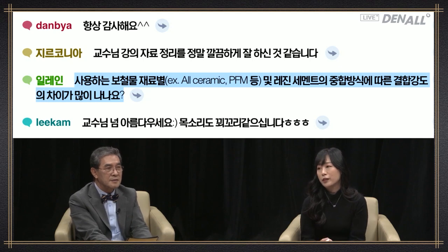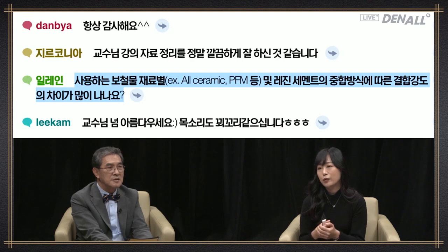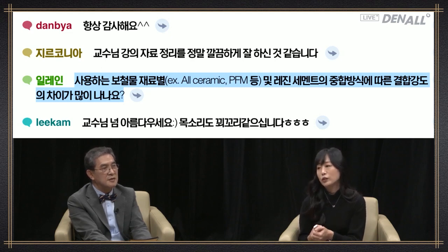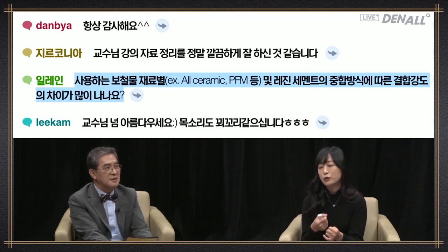as you have asked, in the case of non-precious metal alloy, it is very chemically unstable and it has metal ions, and therefore it has good chemical response with cement. The best is metal crown, metal or PFM crown, followed by gold alloy, and then ceramic. Zirconia is the worst, and glass ceramic is preferred after gold. So, metal, glass ceramic, and zirconia. And this is the order of the strength in cementation. I have talked about difference in cementation strength depending on the restorative material.